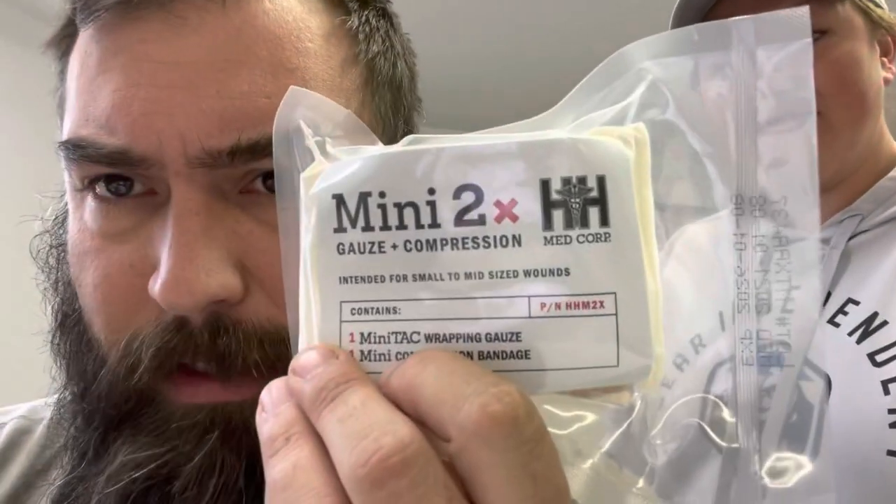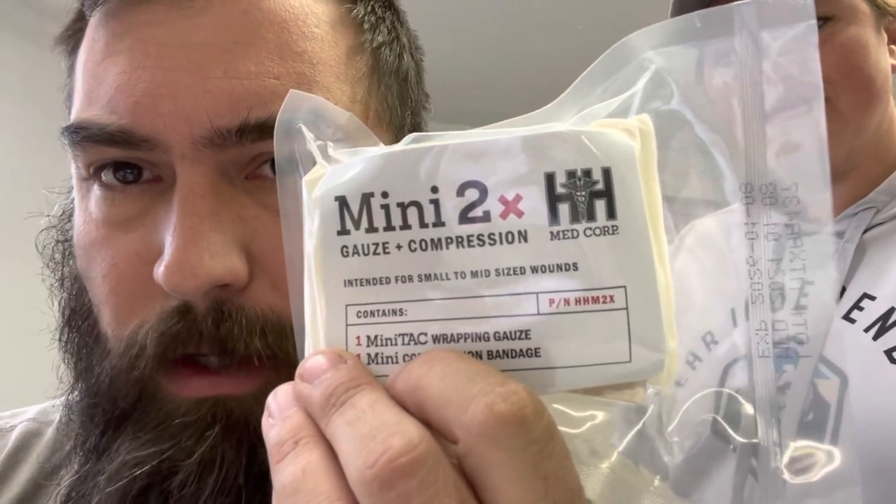We're going to compare a couple of things: the brand new H&H MedCorp Mini 2x gauze and compression versus North American Rescue's Mini Responder four-inch fold-flat emergency trauma dressing. Disclaimer: we sell first aid kits. This was sent to us by H&H as a trial - we know nothing about it, so we're going to pop it open and see what it's like and make a determination.